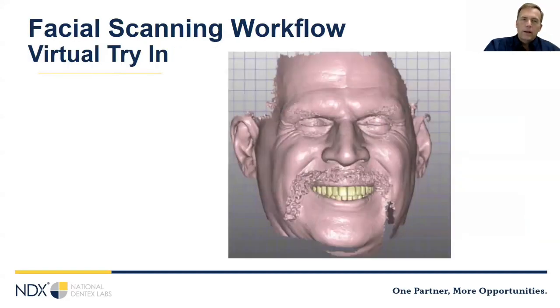Well, you're like, cool, but who cares? The design is scaled to the person's face. So you'll find pretty quickly that you don't really need to do physical try-ins with these cases, because you can show the patient and look at it yourself in one of the free 3D viewers, like the one from ExoCAD, and see how it looks.